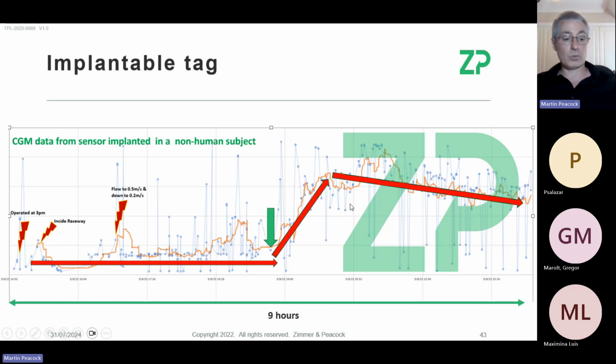That is because whenever, let's take my microneedle system. So I've got my microneedles. I put it on in my watch. So my watch is really the potentiostat. I put it on my wrist. I pull that into my skin.